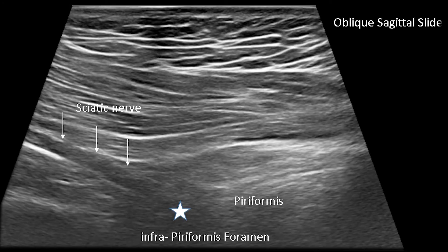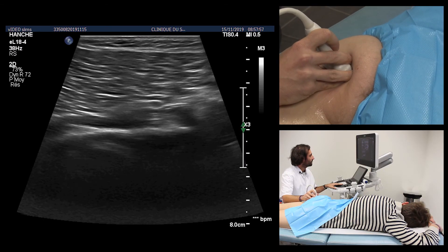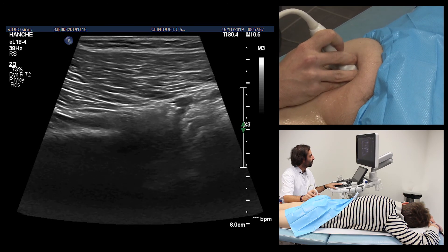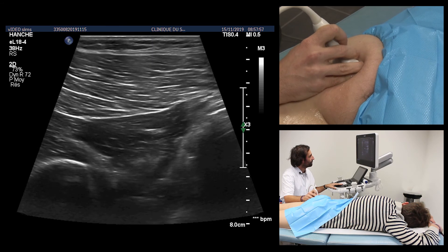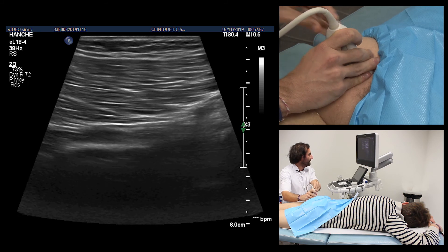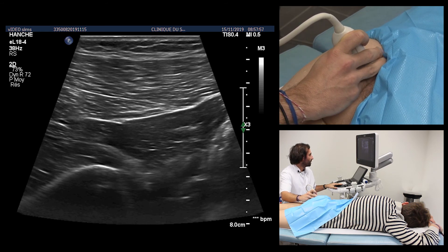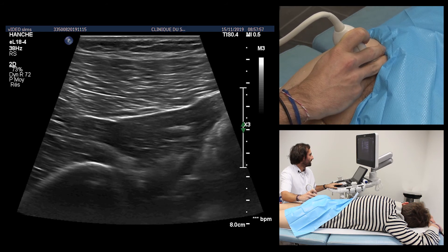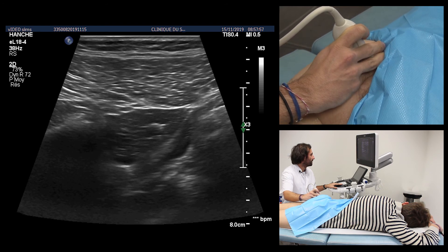We continue to follow this sciatic nerve, which translates medially and deeply at the level of the buttock until the infraperiform foramen. The muscle that is therefore just above the plunge of the sciatic nerve is the piriformis muscle. It suffices to translate the probe, passing from the strict axial section to the oblique sagittal section, to better study this sciatic vascular pedicle at its entry into the small pelvis.